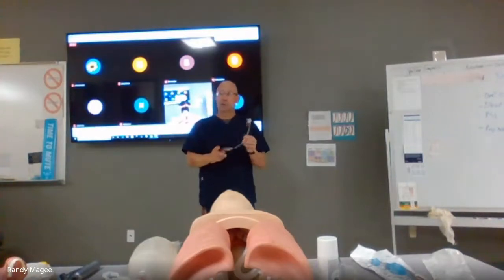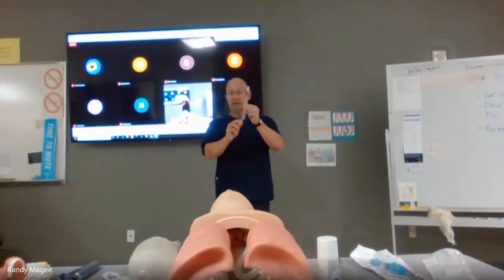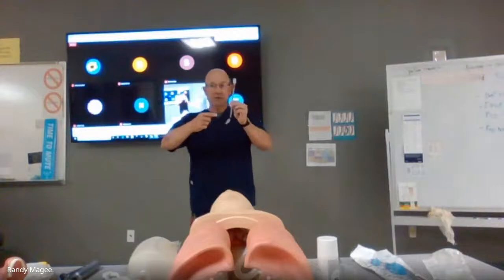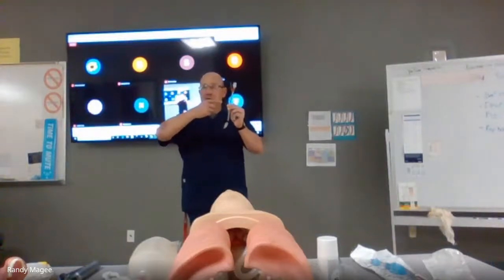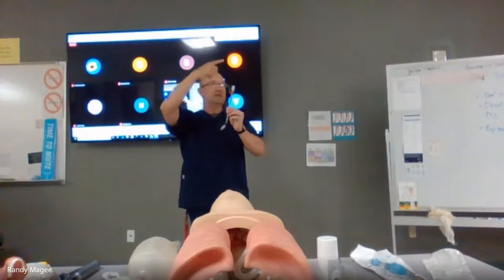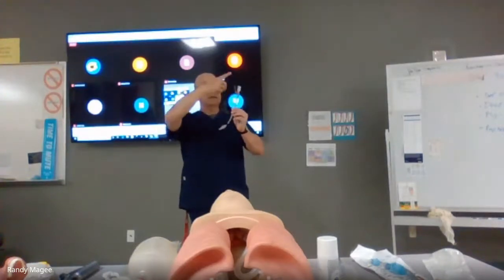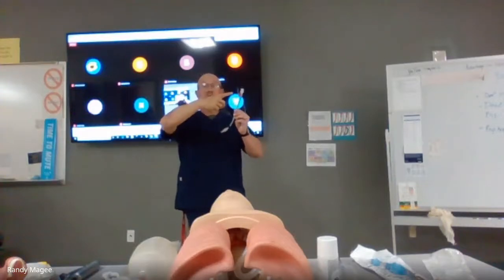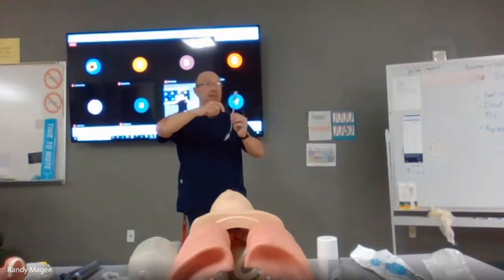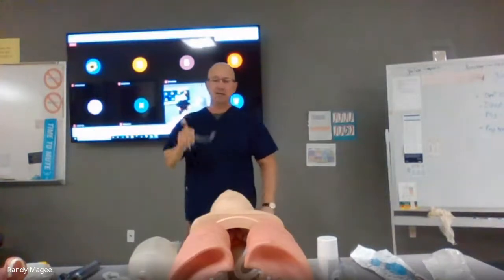confirm the tube, but we'll know it even quicker because when this tube goes into the esophagus, it causes a drastic change in pressure. So the outside pressure is a lot less than the inside pressure. Whatever's in the stomach is going to feed back up through this tube, if they have anything in the stomach. So when you see a green bean coming back up through the tube, you know that you're in the wrong place. You see breakfast in there, it's like, uh-oh, that's an egg, I'm in the wrong place. But we don't confirm the tubes that way, so that's not a huge problem.